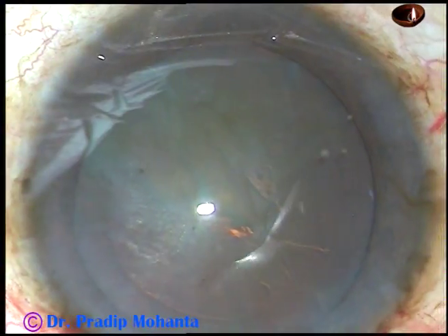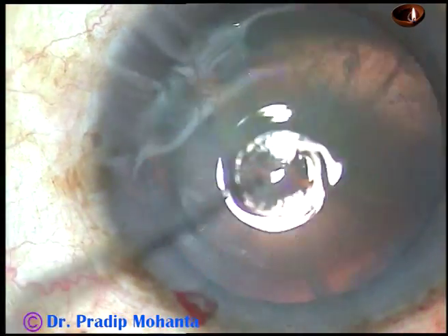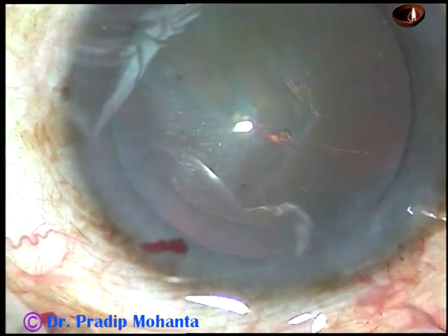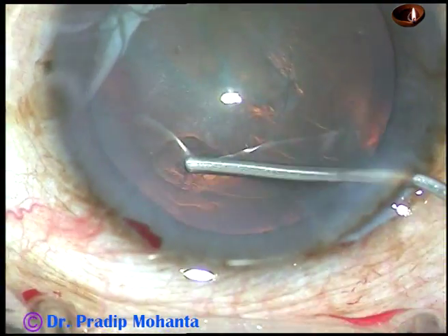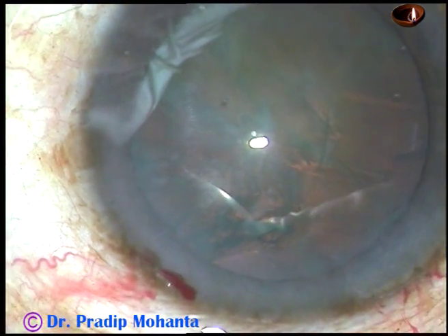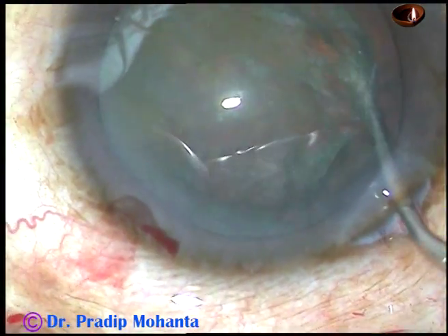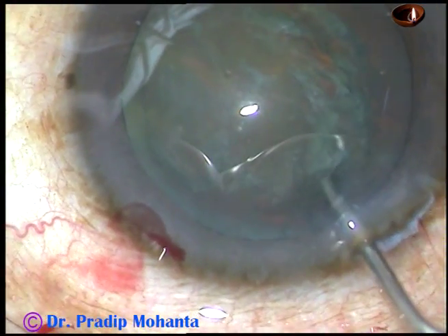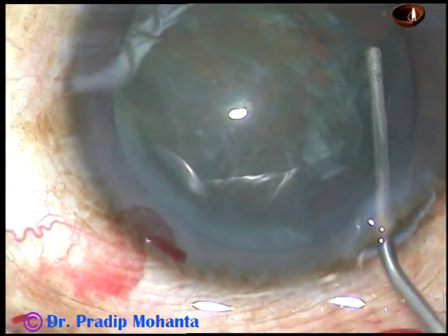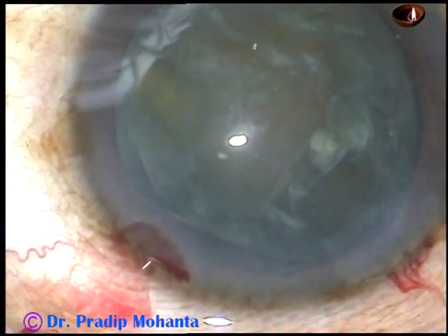Now hydro-rhexis is made, followed by hydrodissection. The size of the rhexis is about 5.75 mm in this case because the cataract is soft and my aim is to tilt the nucleus so that a portion of the nucleus comes into the supra-capsular area. Hydrodissection is being done. The nucleus is tapped. The nucleus has not yet nicely prolapsed, so I do some more hydro — and here it is. The nucleus has tilted very nicely.